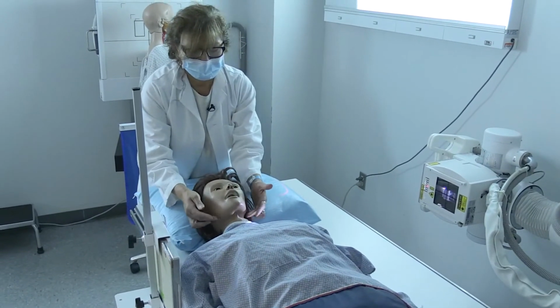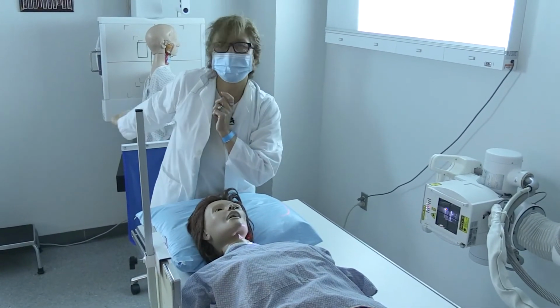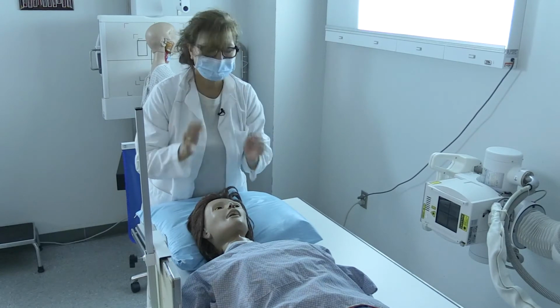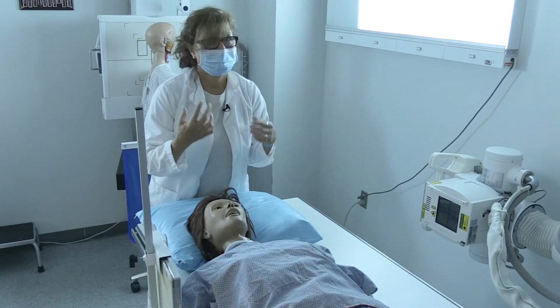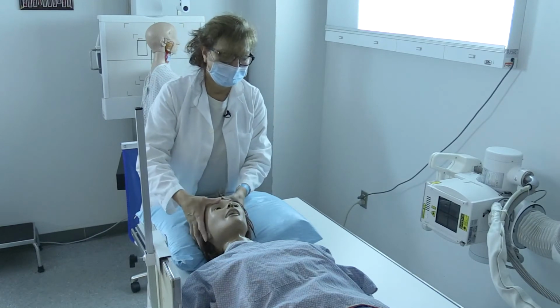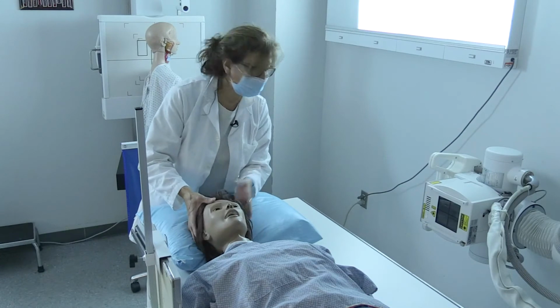And make sure that when you're doing this position or the erect lateral, the mandible is out of the way. So you may want to raise the mandible just slightly so that the angles of the mandible are not over the cervical spine, but again, not too much so that the spinous processes are not being obscured by the occipital bone of the skull.